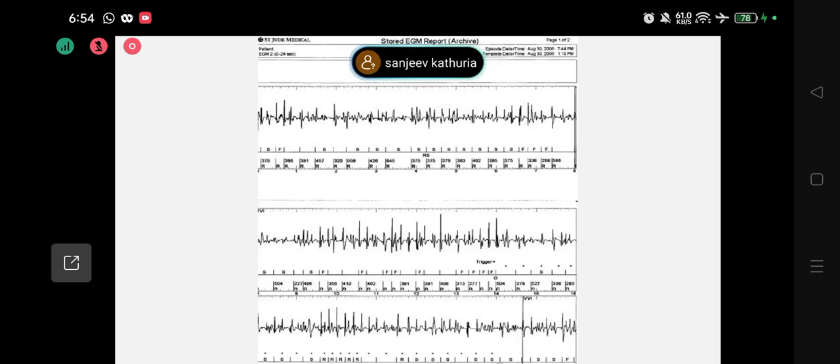So the capacitor is the one which says, oh, this is VF. Okay, the capacitor will start charging. If it is a VT zone, it will give time to the device. Please take a decision, you are the judge, you take the decision. But if it sees VF, it is like a murder has happened in front of you. It will say, I don't need anyone, no judge, no lawyer to defend. This is death in front of me.